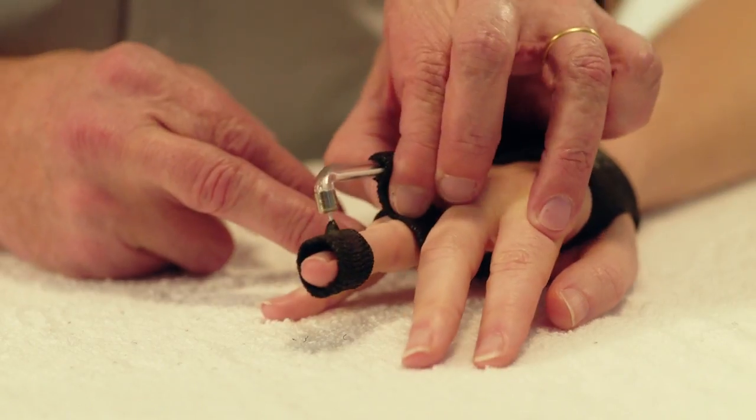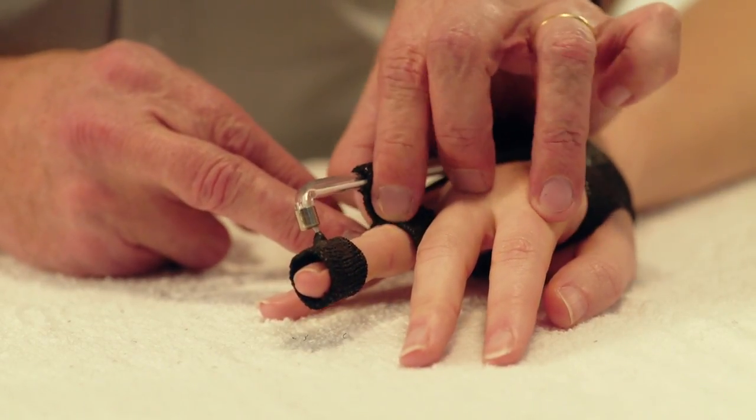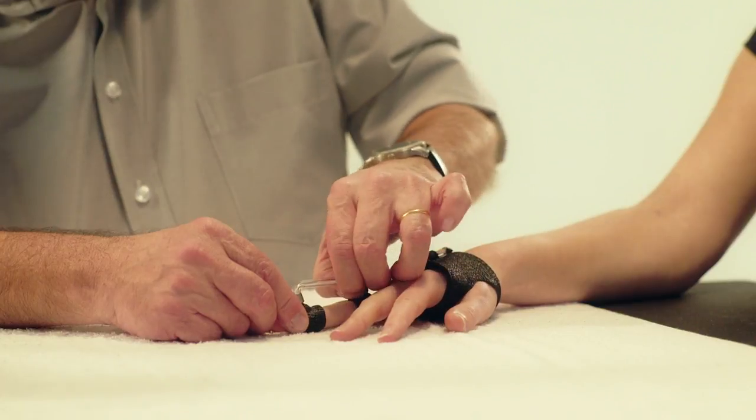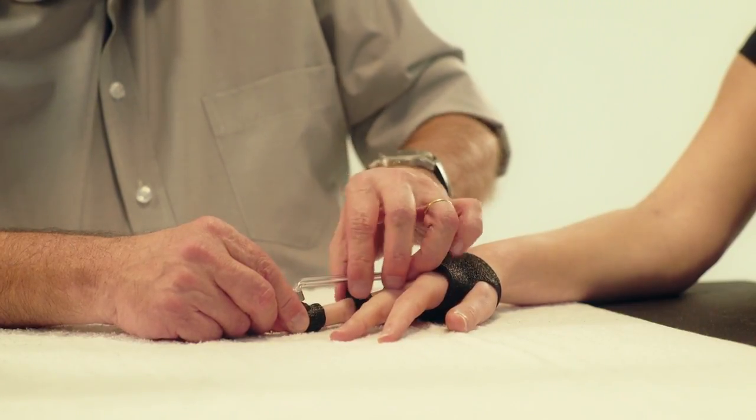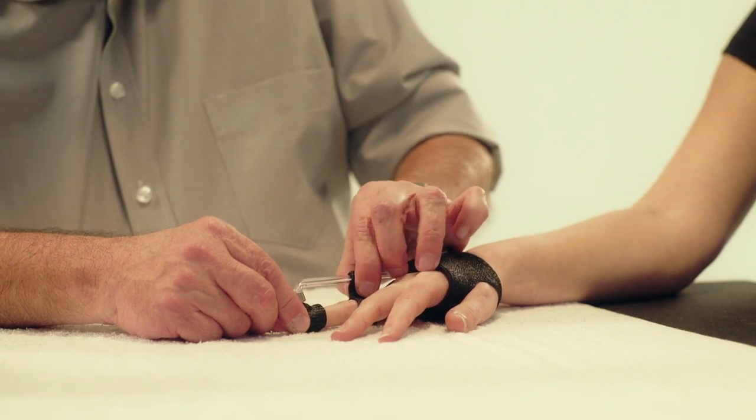Put the finger in the desired position, excluding any hyperextension. Press the OrphiCast together and mold the stop over the finger. Wait until the stop has hardened.